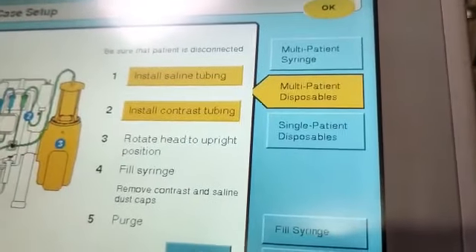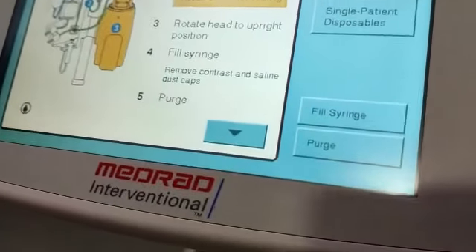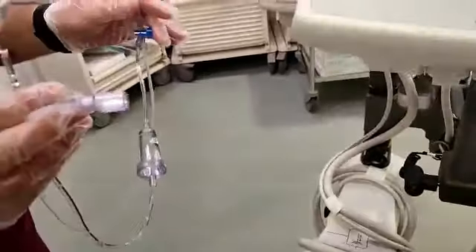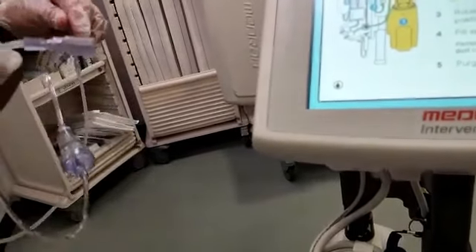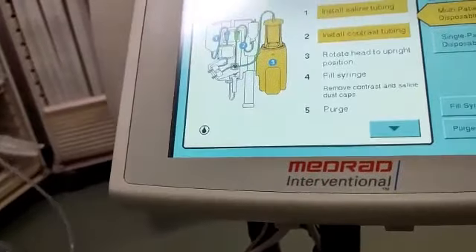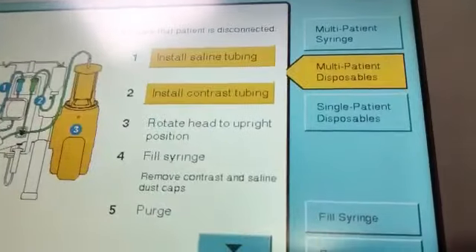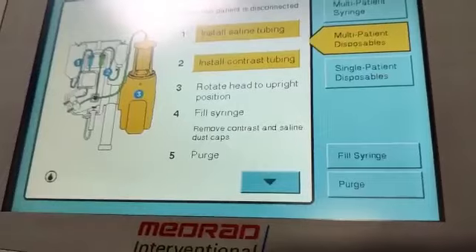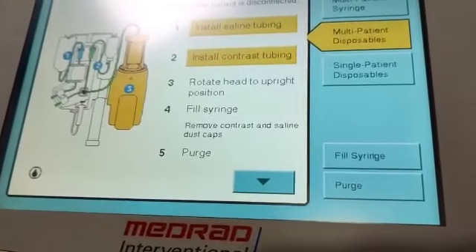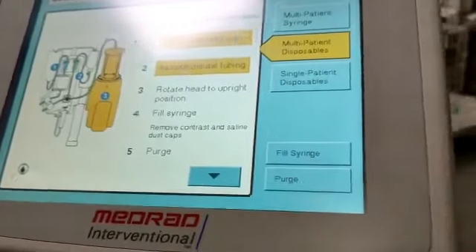Now we are done with the first instruction. The second instruction is for the multi set. This machine comes with two types of disposable sets. One is called multi-patient, which can be used for multiple patients — if I do one procedure today, I can use it again for another procedure today. The other set is single-patient, meaning it is single use only — once I use it for one patient, I have to change it for the next patient.